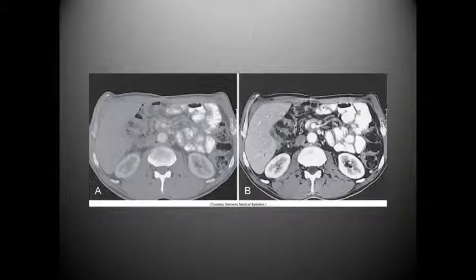Here's another example. Notice how gray image A is in comparison to image B. Gray to the extent that you can really visualize the spine and you can see the ribs very well, but in terms of the contrast enhancement in the liver, you can see these tiny dots but not very well. You can see some of the bowel enhancement, but that's pretty much it. You get no definition on the right side. You can see the kidneys, and you can see that they have contrast, but notice how gray it is.